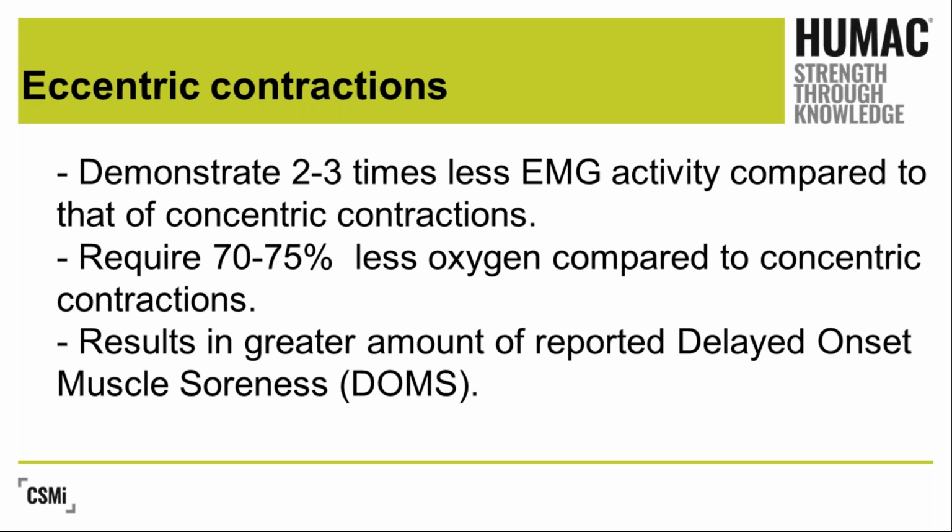One of the reasons they advertised their popularity is they said you could exercise without the muscle soreness, because most of their machines were designed to do concentric reciprocal exercise, and they weren't doing eccentric loading types of exercises.